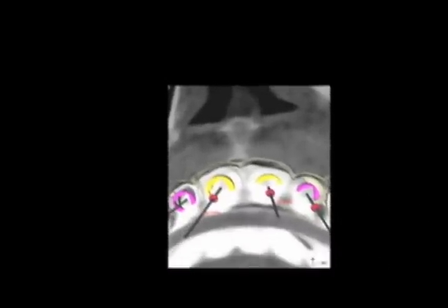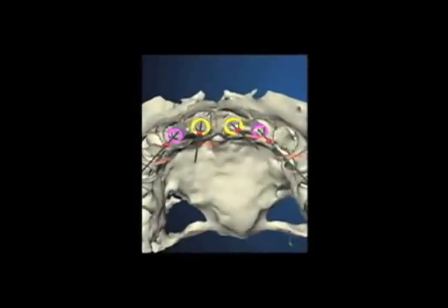It's not a difficult procedure, and they can have their smile the same day. First, the doctor does a CAT scan to get a 3D image of her entire jaw. Then a computer generates a blueprint of Jennifer's virtual smile. That blueprint is sent to the laboratory, where a complete model of perfectly fitted teeth are created.